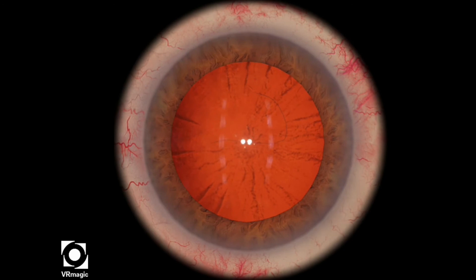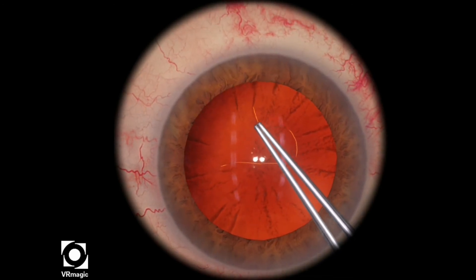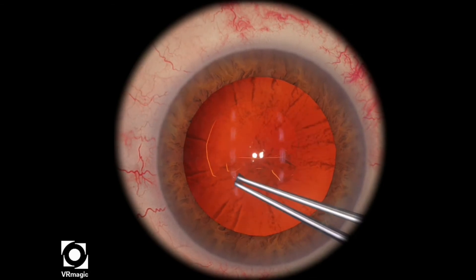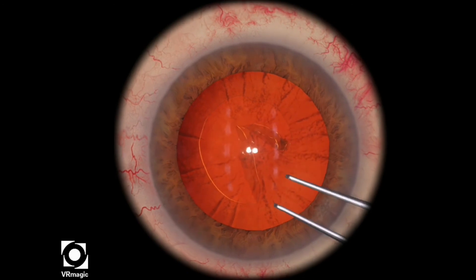There at the 12 o'clock area, it's run out a little bit. You notice that it's not perfectly round. So I pull a little bit towards the center and then I start propagating my rhexis. The size of the rhexis is now based on where you've started that Little's rescue maneuver.